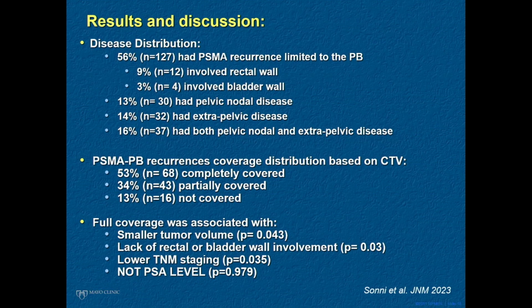You can see here, I won't go into all this data, other than to see that when you looked at the PSMA compared to the salvage RT volumes or dosimetry, you can see that they completely covered it in a little bit over 50% of the time, and about 30% were partially covered, and about 10% were not covered at all. So this explains some of the salvage radiation data, right? Which again, if you look at 10 years, only has durable PSA control of about 60% of patients, because a lot of times in the salvage, they were radiating blindly, and sometimes perhaps missing the disease.